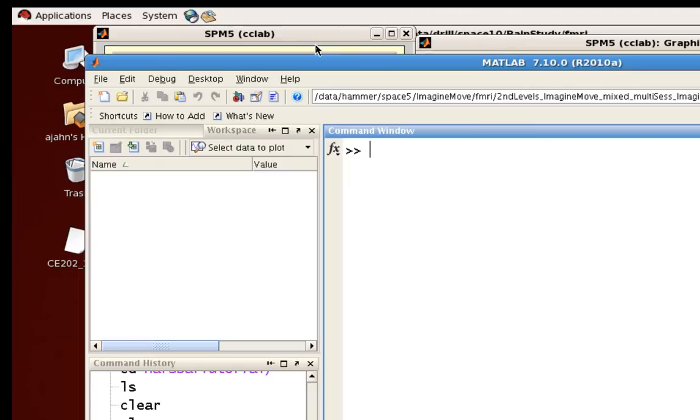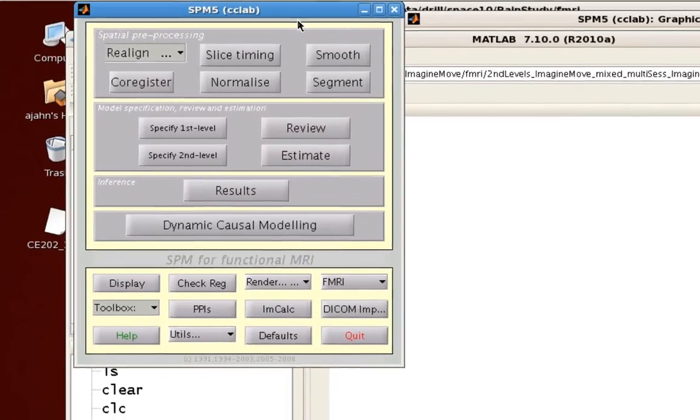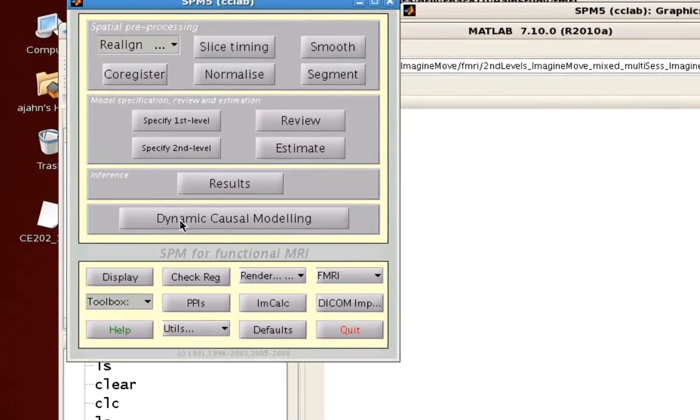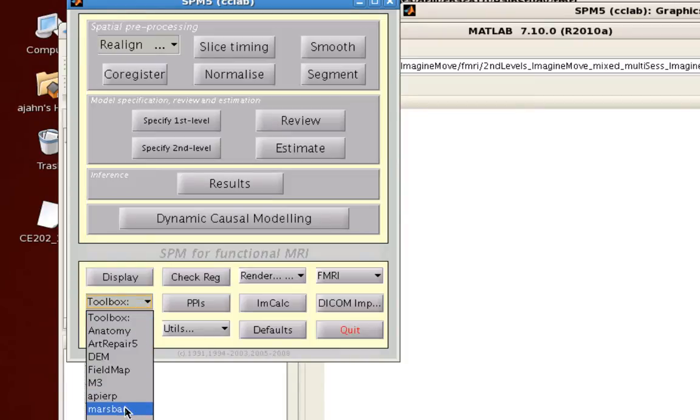So assuming that you already have MarsBar installed, from the SPM5 graphical user interface, click on the Toolbox drop-down menu and select MarsBar.